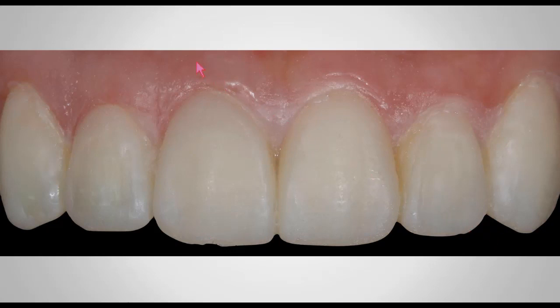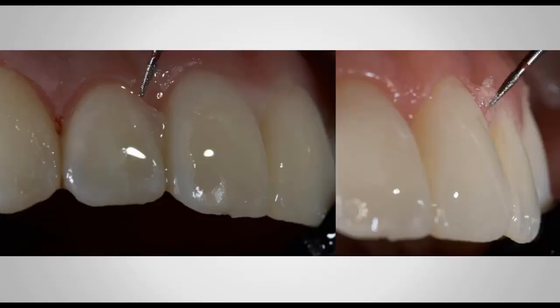So once I'm done with this and once I'm done curing, the next step is going to be finishing. So you can see the type of burr, a very fine, red stripe or yellow stripe, fine diamond burr, a very small needle shape diamond burr. And you're going to use that needle shaped diamond burr, and you're going to go just into the gingival margins, right around the tooth, just to remove all the flash.